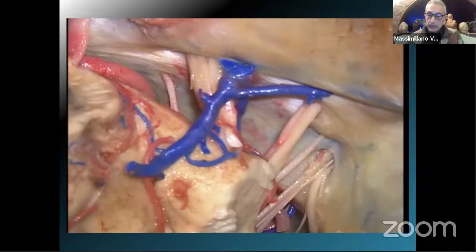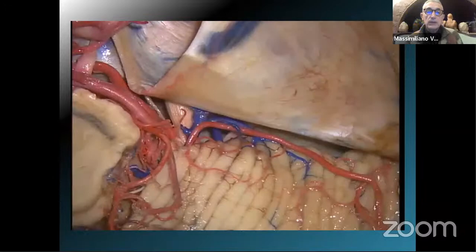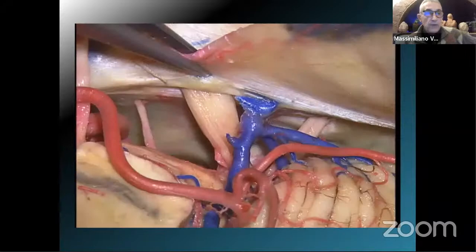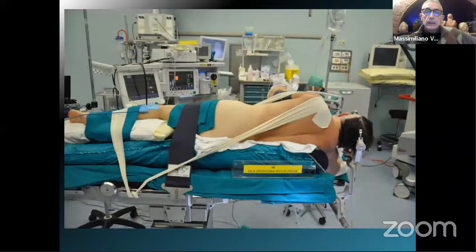But right now I try to preserve it as much as possible, since venous circulation is strategic in this complex and intricate local anatomy. And as we can see, we can deal with the fourth nerve, the third nerve, or close to the fifth nerve, and any vascular damage close to this intricate anatomy can result in postoperative undesired dysfunction, permanent or transient. But let's see some special cases.